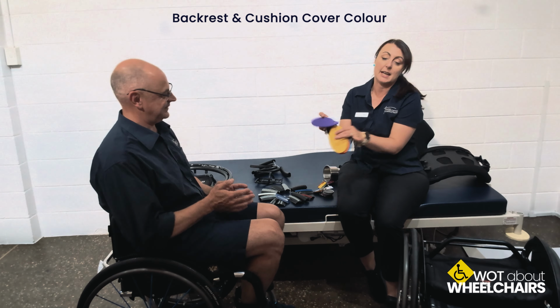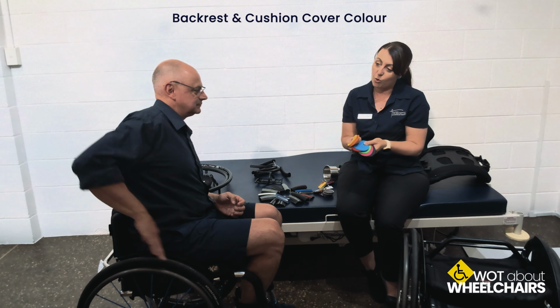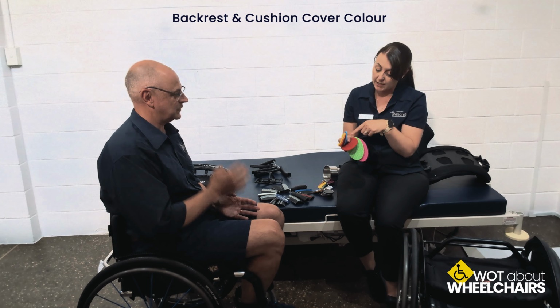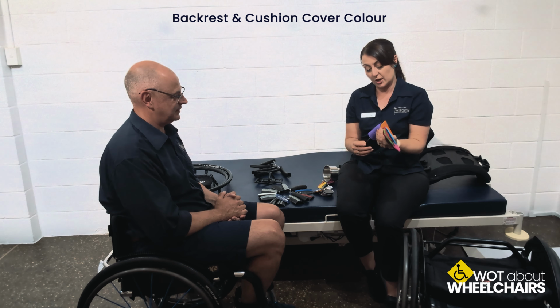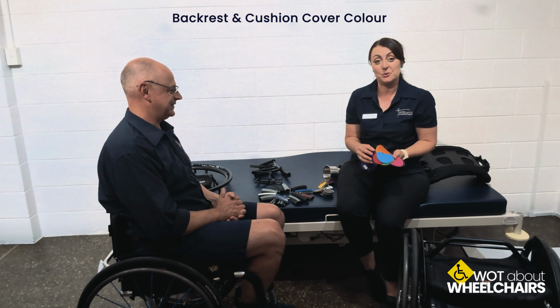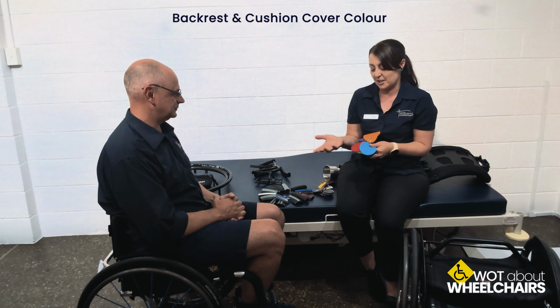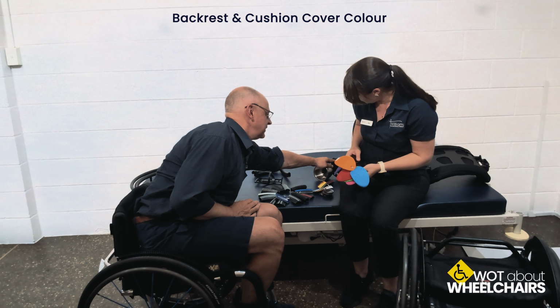Now, here are fabric choices as well. This is probably more relevant for custom backrests and the accessories or postural supports that go onto your chair. I did have this for one of my clients who was a North Melbourne supporter. So she wanted her wheelchair in blue and white. And sometimes we'll even look at a cushion cover which is individualised if that's what the person wants. So that is a choice.